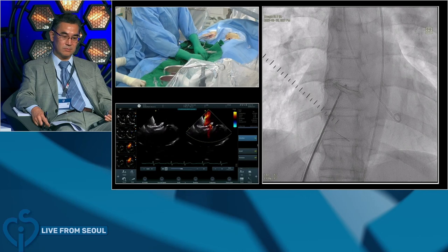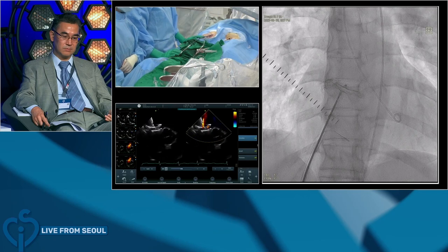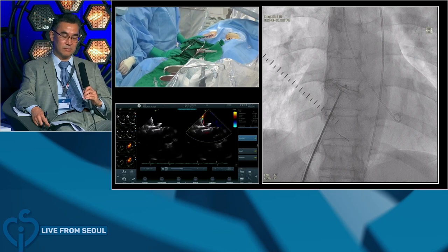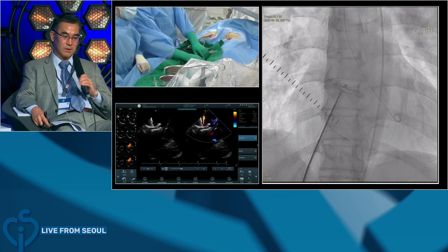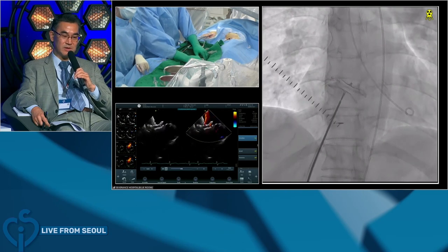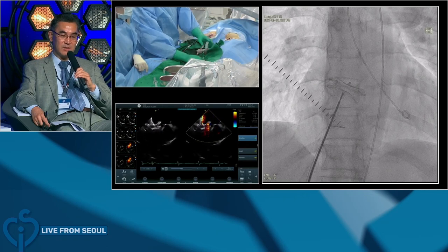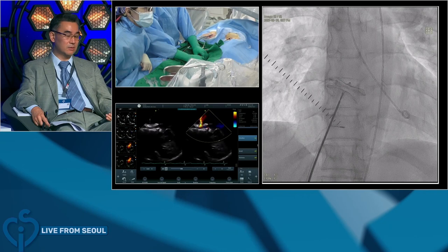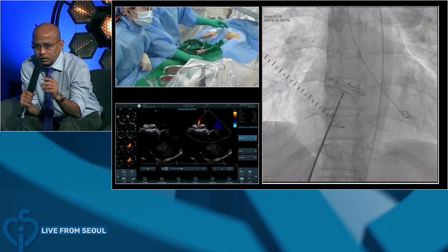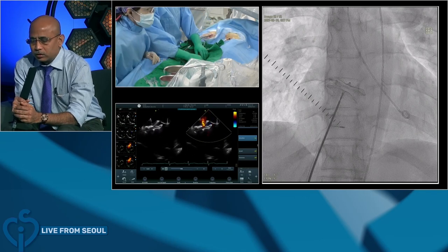I know that many of the Japanese doctors prefer splaying around the aorta rather than pinching on the aorta. Yeah, when we are using the Amplatzer device, I think just pinching is going to be okay. But in this particular patient, the posterior rim is really flimsy. I think it doesn't work. Yeah, maybe the two opposing rims, especially the retroaortic rim and the posterior rim, were very floppy. That made the effective diameter of the defect quite large. So maybe we can put a little bigger one.